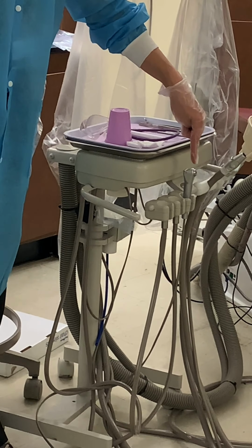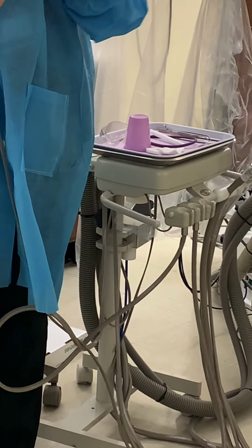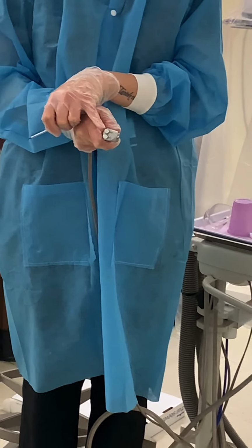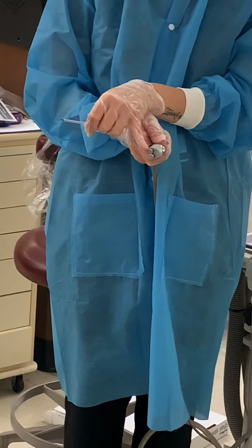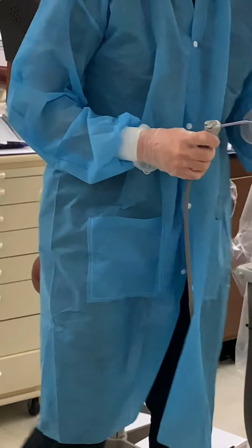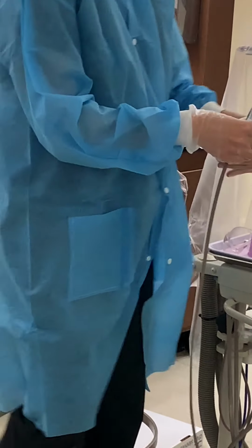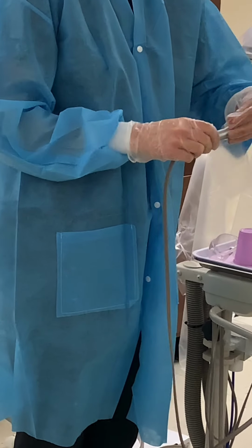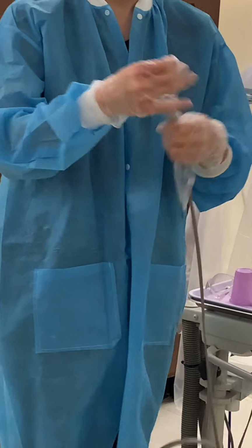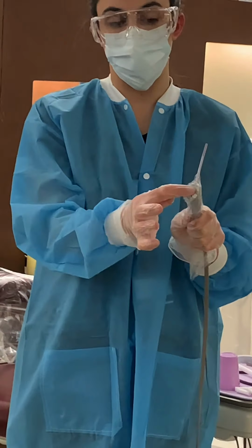Next up is your air-water syringe. Same thing. Look at all these little nooks and crannies. I mean, it is literally impossible, you can't clean this with a wipe. There will still be, like in a court of law, you could still swab underneath here and get germs that are caught underneath it. So it is recommended to also use a cover, an air-water syringe cover or a saliva ejector cover, whatever you want to call it. But that's just how they work. So it stays on, and you can still operate your water and your air. The little emojis here tell you which one's which.